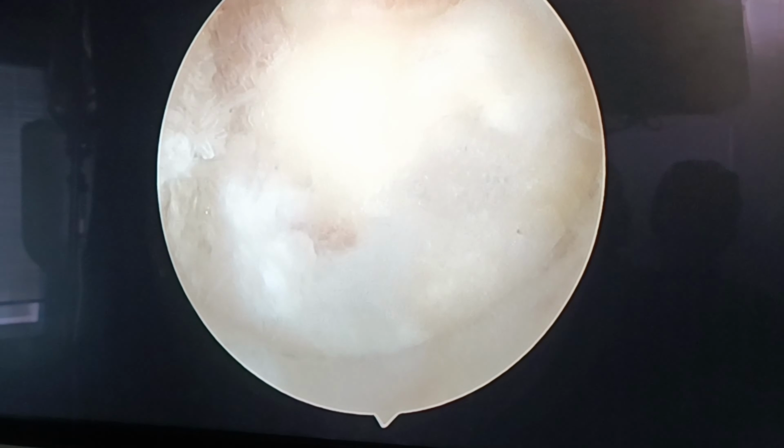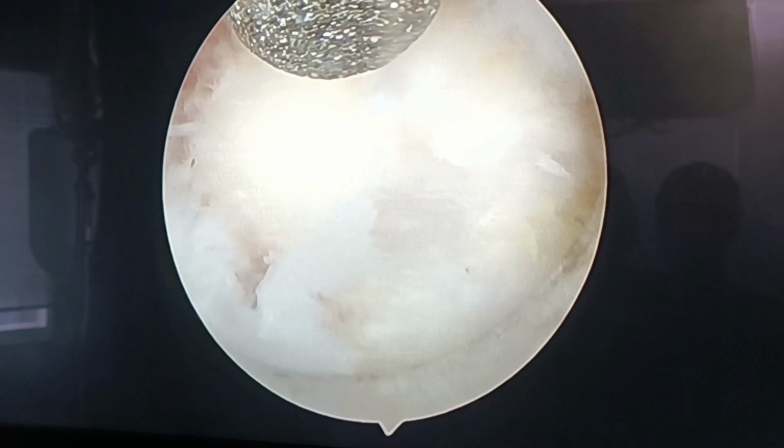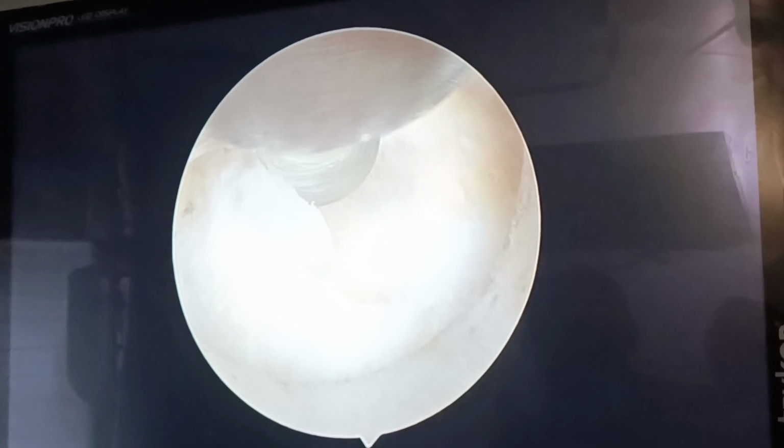Once I have done enough drilling of the superior lamina, I will turn towards the inferior drilling, that is SAP of D11 and superior part of lamina on the same side as well as opposite side.